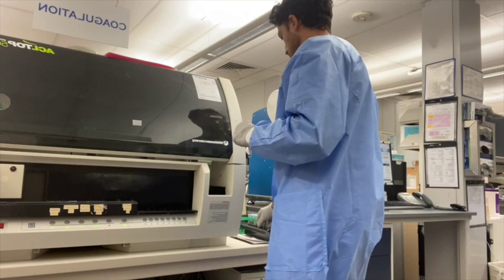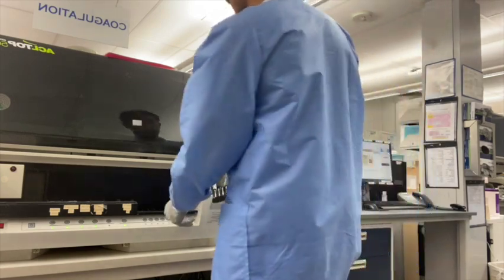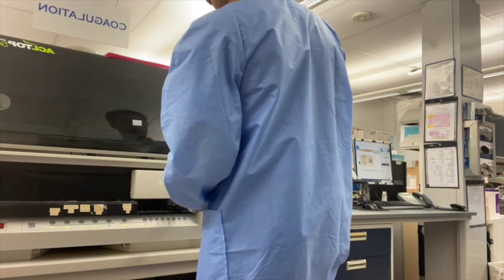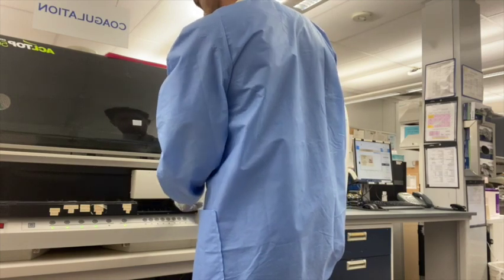We spin it for 5 minutes. That's what it looks like afterwards. And so now we can use that serum or plasma to run the tests ordered. And so here's me loading it into the machine.